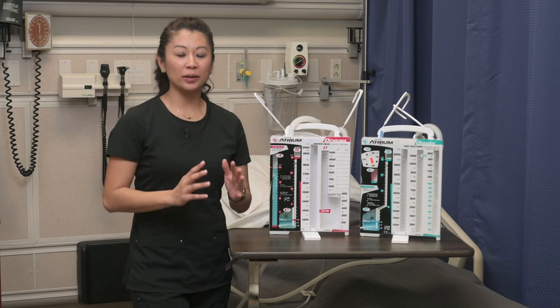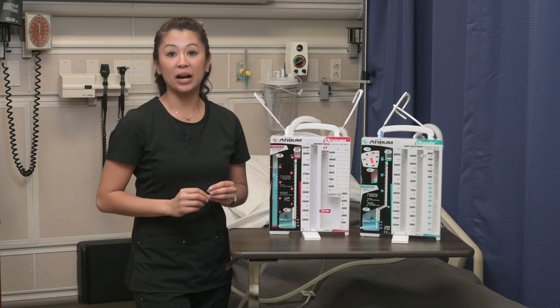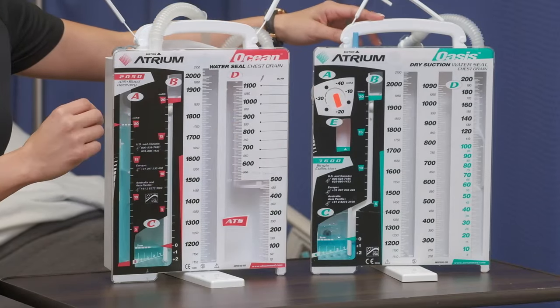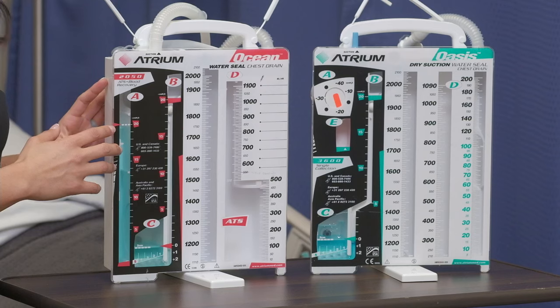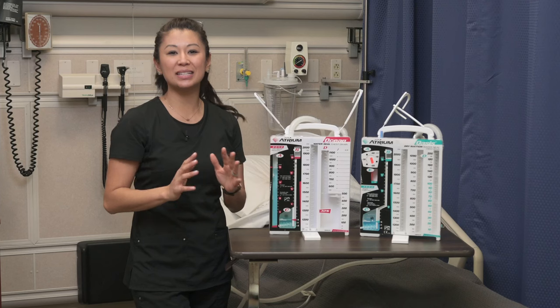During the presentation we talked about wet suction and dry suction, and that's what I've got here. If you remember, think 'dial' for dry suction — I've got my dry suction canister here and my wet suction canister here. So let's take a look at these and compare.